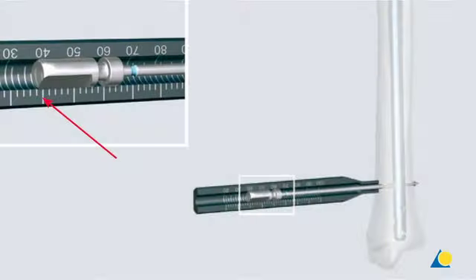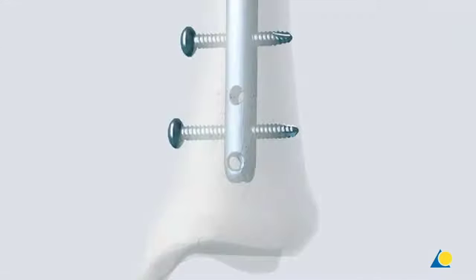The direct measuring device is slid over the drill bit, and the appropriate length for the locking screw is determined from the measuring device at the end of the drill bit. The appropriate length locking screw is inserted using the screwdriver star drive T25 and the holding sleeve if needed. The screw length is verified under image intensification. A second locking screw may be inserted using the same technique.